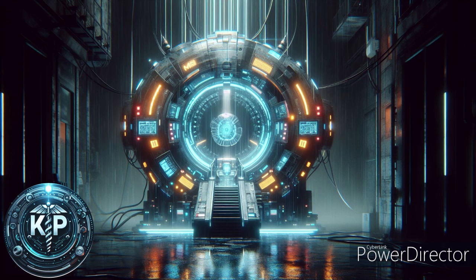Surface coils. These are small RF coils placed close to the body part being imaged. They provide high-resolution images due to their proximity to the anatomy of interest. Phased array coils. These coils consist of multiple elements that can be used simultaneously to improve signal-to-noise ratio and accelerate image acquisition.